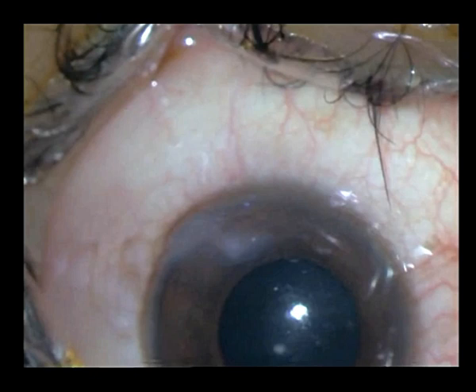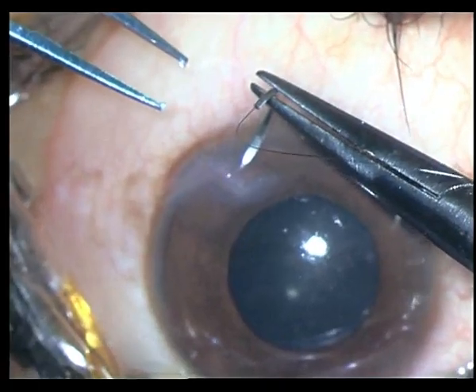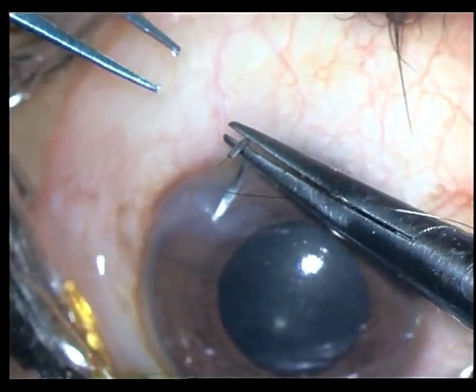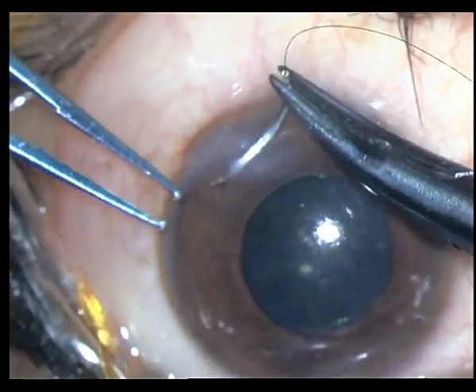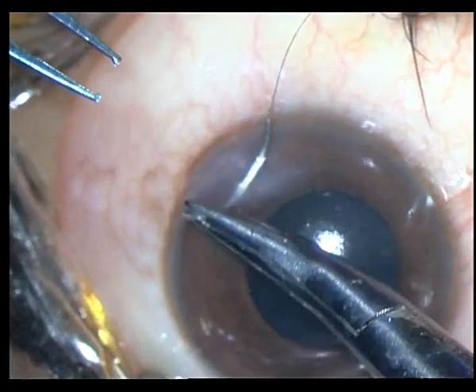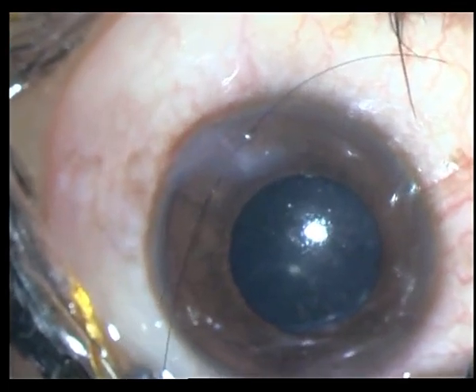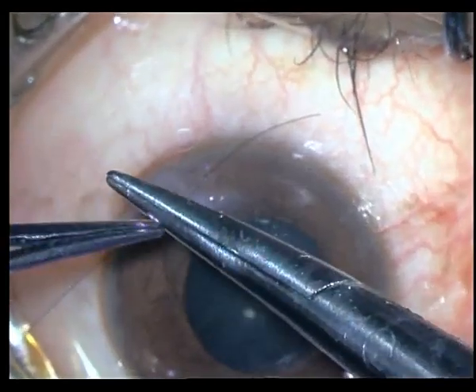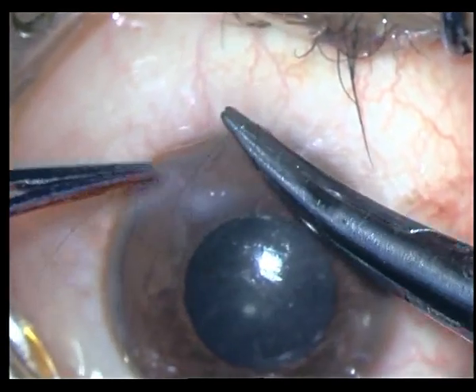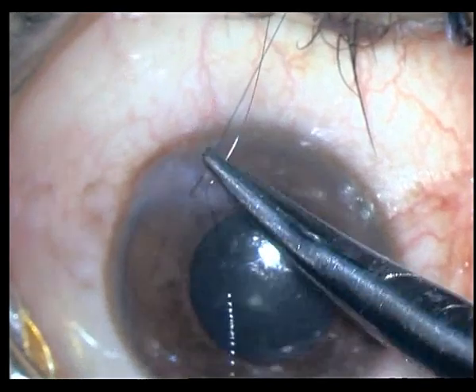Initially I am going to handle the corneal tear. He has come a few days later, so the edema itself has sort of semi-sealed the wound, but you cannot leave this wound unsutured as the seal is Seidel positive on pressure. So initially I am going about somewhere close to the center, taking short bites on either side.